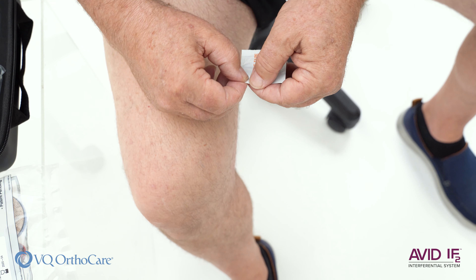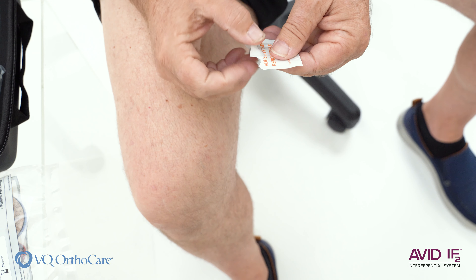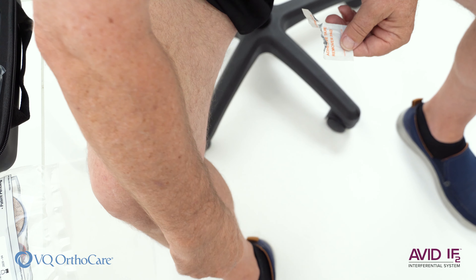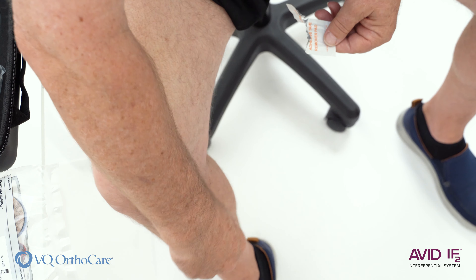When your treatment is complete and the device is off, remove the electrodes and place them back on the plastic sheets, then seal them in the plastic bag for optimal life.